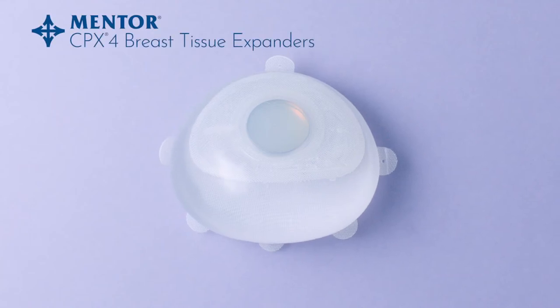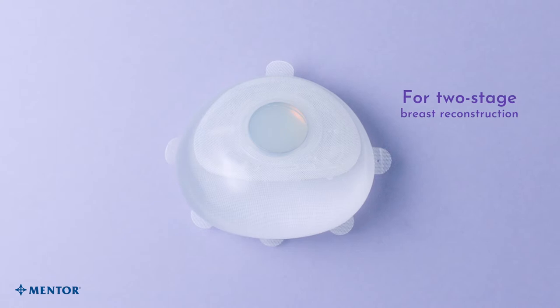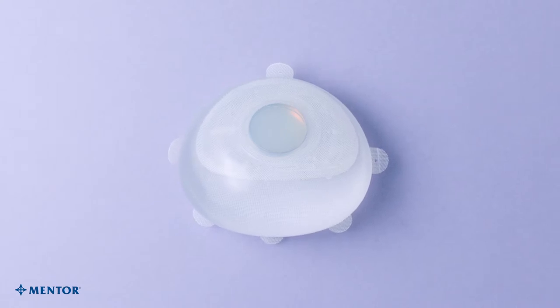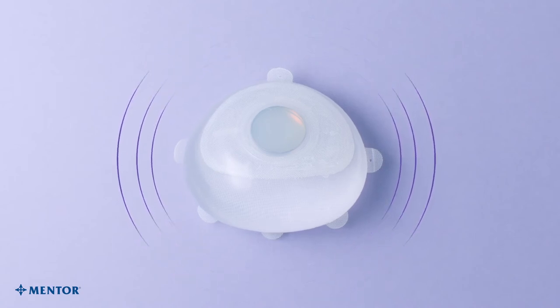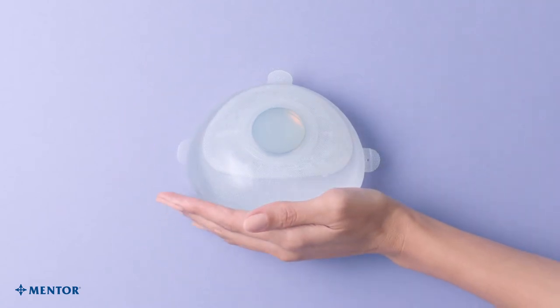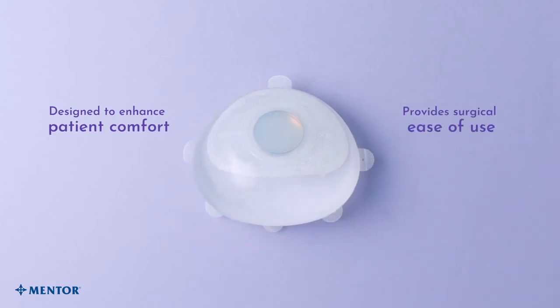For the thousands of women who choose breast reconstruction, a two-stage surgical procedure involves the use of tissue expanders. They help patients achieve desired results and make room for the implant by stretching the skin and tissue. Our CPX4 Breast Tissue Expander is designed to enhance patient comfort and helps facilitate surgical ease of use.